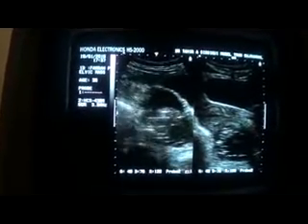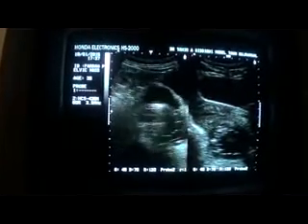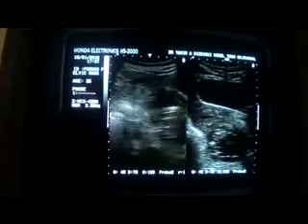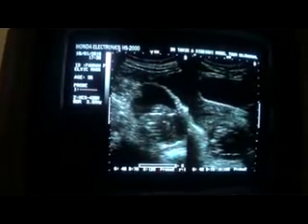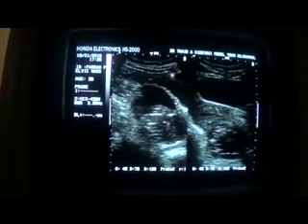and then it is traced up to the lower abdominal quadrant, where it is bounded by a membrane. Now this is the urinary bladder. This is the urinary bladder.